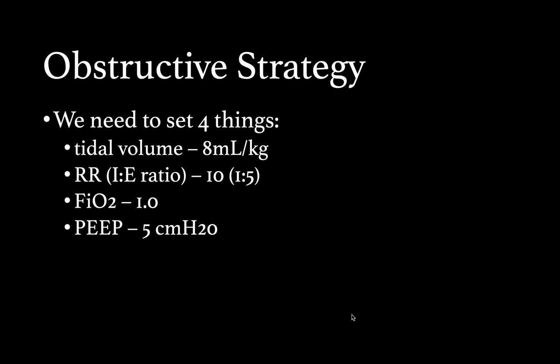We can start with an FiO2 of 1, and in the obstructive strategy, we don't want to be too generous on our PEEP, so we'll start low with 5 centimetres of water.